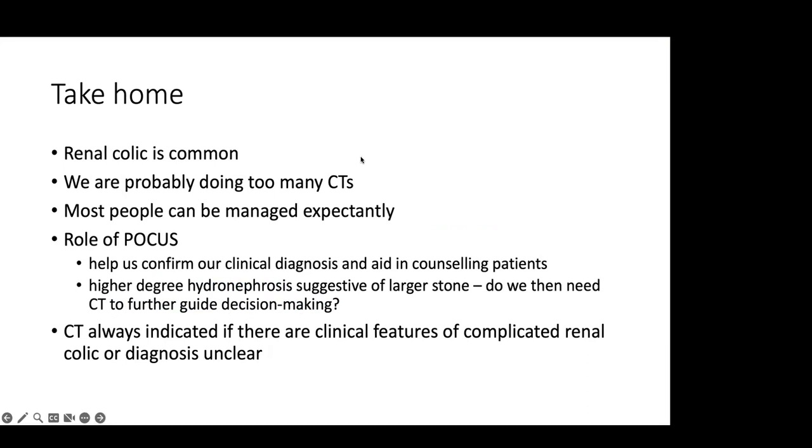Thanks, Elisa. I guess what I wanted to say was it shows you, I think, with the modality, as long as you understand what the pitfalls are of using it, when to use it in the patients, and when you need to know to pull the trigger to do some more advanced imaging. I think that's the key.